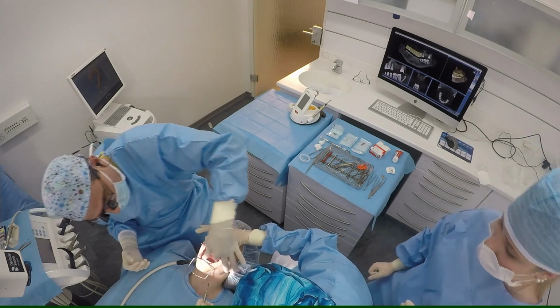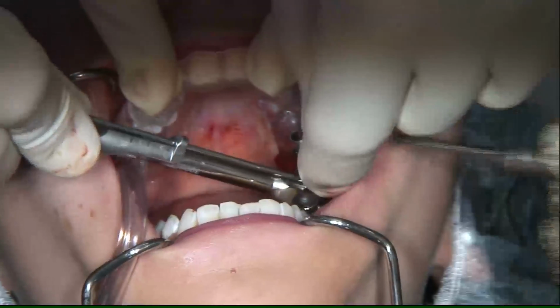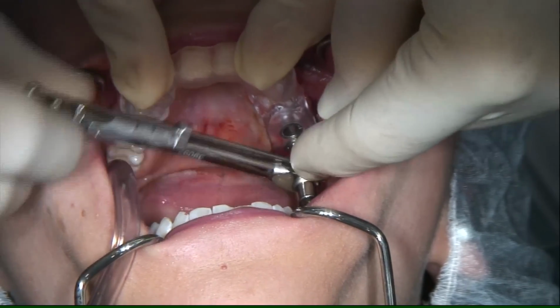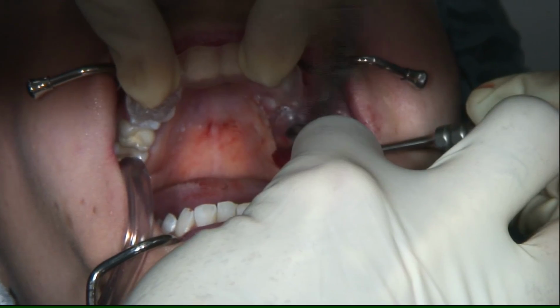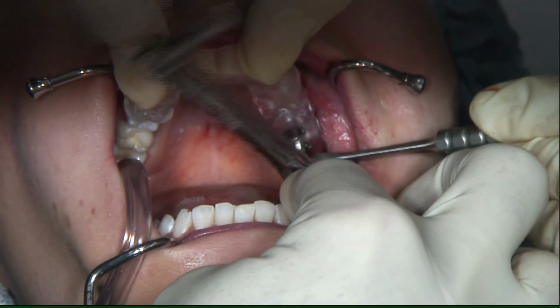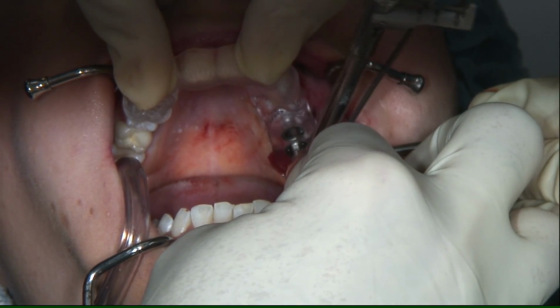So the implant with the Friadent temp base is now placed in the cavity through the template. And now he is switching to the ratchet to give some torque control. The speed when placing implants must not exceed 15 rounds per minute to prevent heat necrosis. Slowly the implant is screwed to its final position.